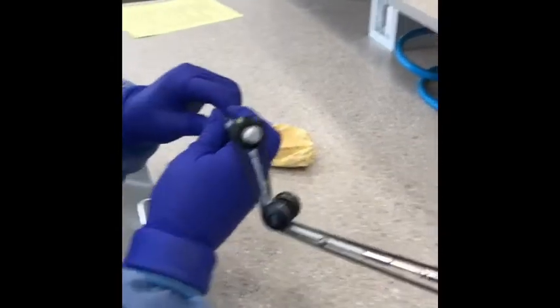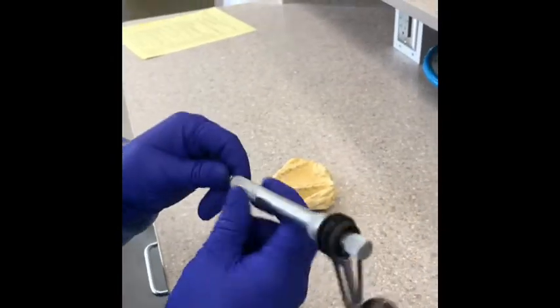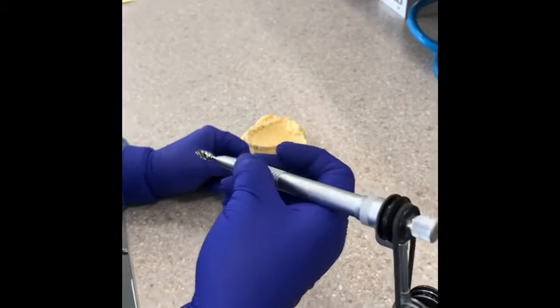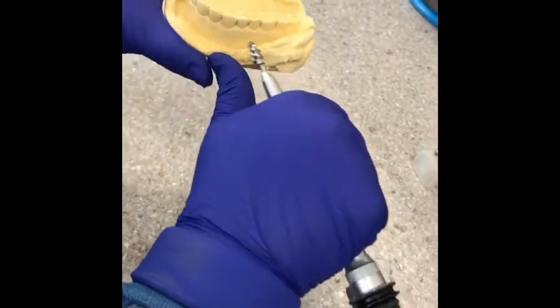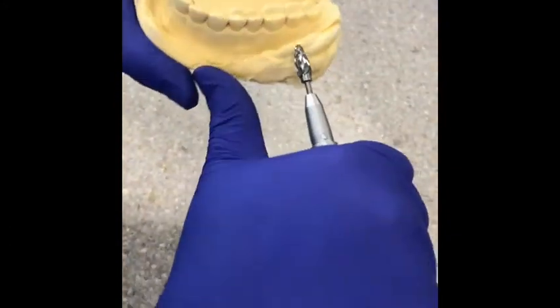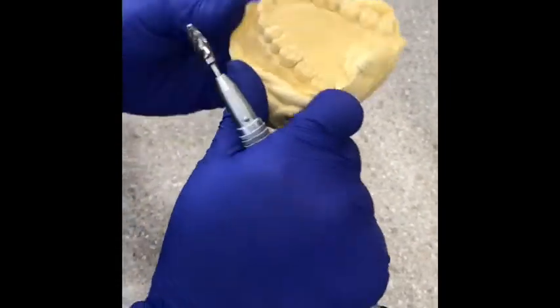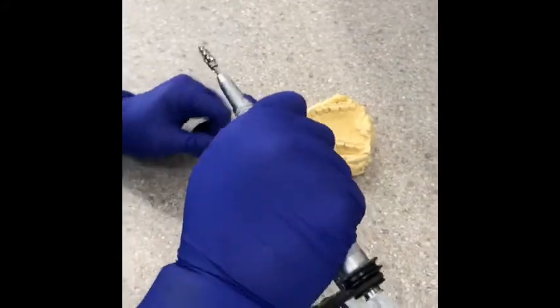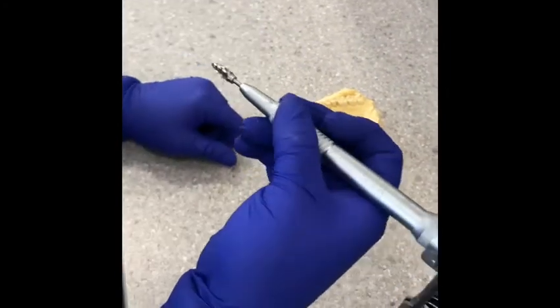in the lab. All right, so when you take the handpiece, there's two different ways to use this. You would hold it in a pen grasp, just like this, like how you would use a pencil or anything to write. Then there's also the palm grasp, where you would actually grab it like this, use your thumb as what we call a fulcrum, and then you could adjust the margins of your model, smooth them out if you need to. We'll get into how to do that once you guys have your models trimmed in lab, but I did want to just show you the two different ways to grasp the handpiece itself.